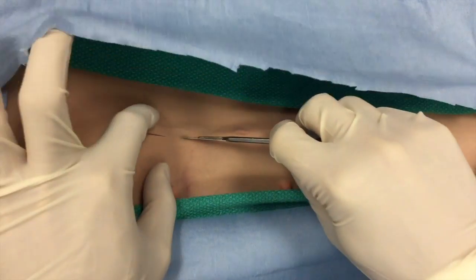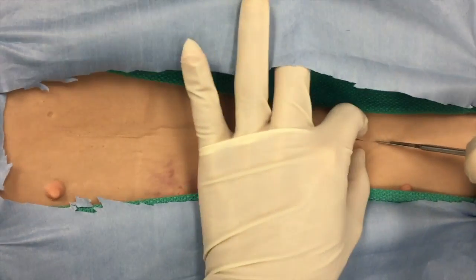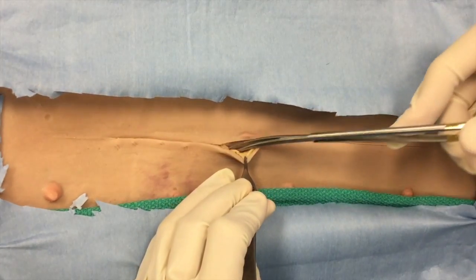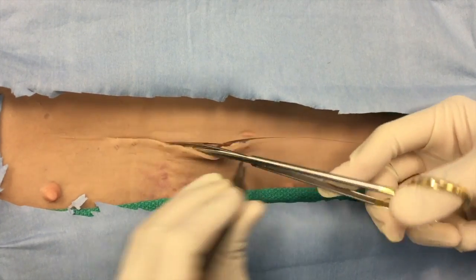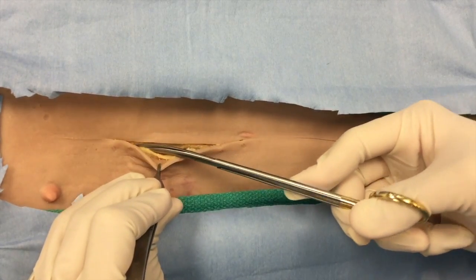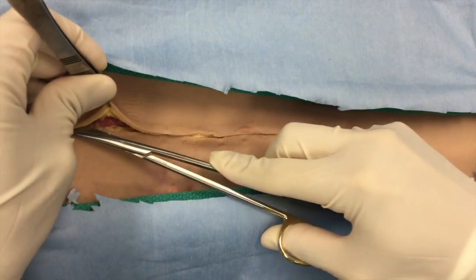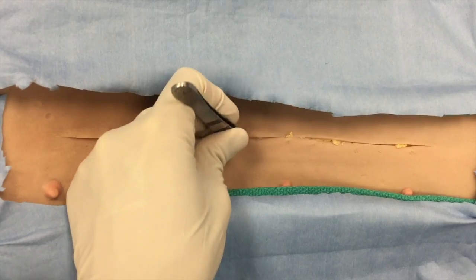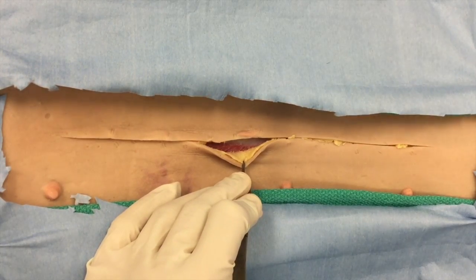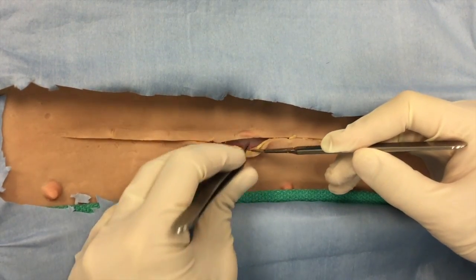A ventral midline incision is made from the xiphoid all the way to the pubis through the skin initially, then slight lateral subcutaneous dissection is performed with Metzenbaum scissors. This requires a nick into the subcutaneous layer and then extension of the dissection cranially and caudally. We can see here the white linea alba.